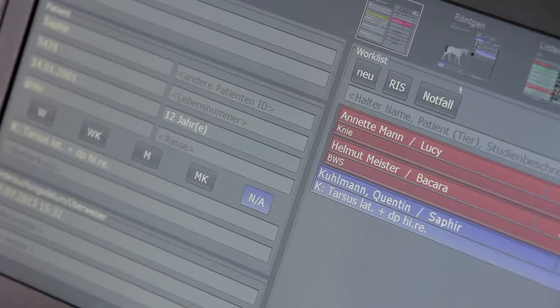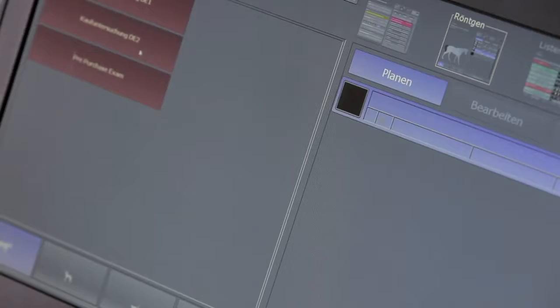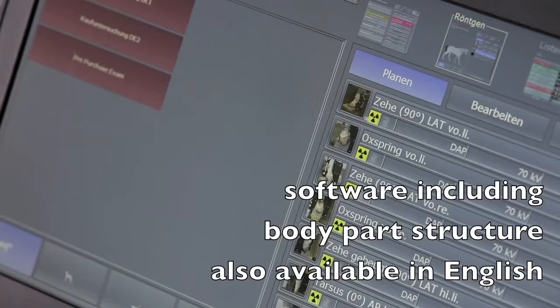The professional acquisition software is the answer to all your wishes in terms of optimal work process, special measuring functions, as well as image transfer options.